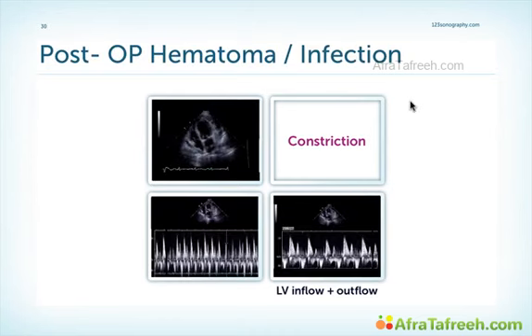And this here is a patient who is developing constriction after fibrinous pericarditis. Note that we have pericardial effusion with a lot of fibrous strands within the pericardium, and that we do have abnormal motion of the interventricular septum. There is a septal bounce. In addition, you can see that there are respiratory variations with a steep decrease in the velocity during inspiration, and we also have a fairly high E wave with pulse wave Doppler across the mitral valve. So this is an example of a patient who has pericardial effusion and constriction at the same time. This is what we call seroeffusive pericardial constriction.